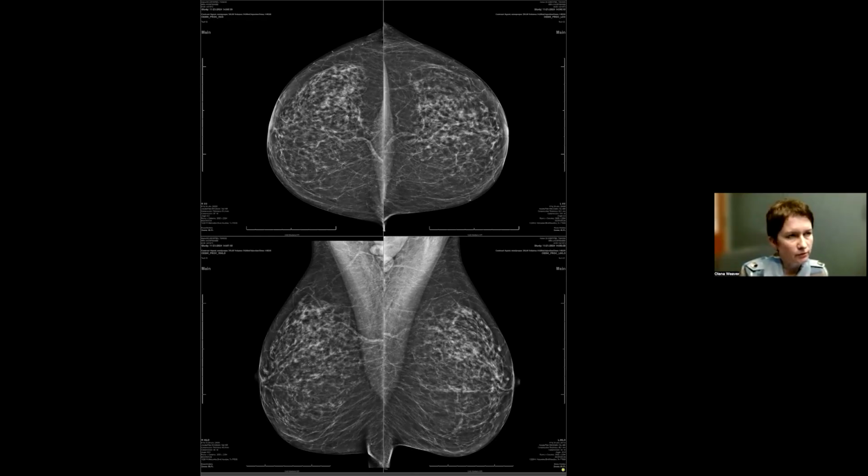So this is a 51-year-old woman with no complaints. She presented for a screening mammogram. And here we see on the top craniocaudal low energy images. They are equivalent to our full field digital mammography images, and they are read that way. So we are first looking at low energy images, just like your regular mammogram. First, you want to get a good idea of whether there are any suspicious findings on low energy images before you even proceed to recombine images.